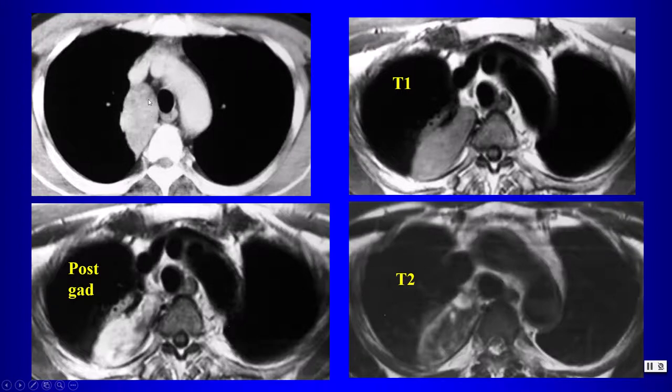So what's happening here on the CT scan, we have a pleural lesion. It's a different case. So we have a pleural lesion here that is enhancing on the CT. Here on MR, it does enhance after gadolinium. Notice the T1 and the T2 weighted images here. What is the clue that this is a fibrous lesion? Well, usually neoplasms are bright, have increased signal intensity on T2 weighted imaging, but this lesion is dark on T2, which tells you it has a high fibrous content. So think of what leiomyomas look like on MRs of the pelvis, leiomyomas of the uterus there.